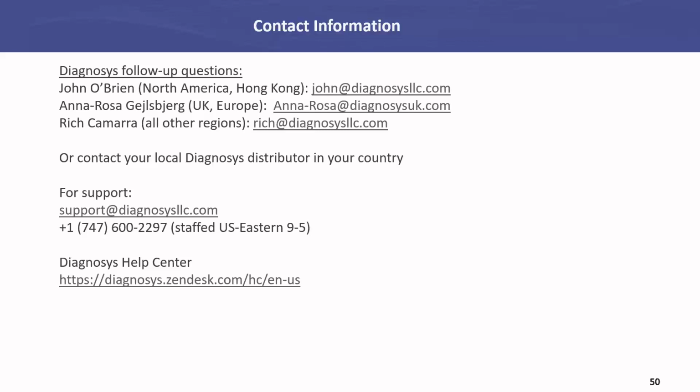I know you can get better responses if you use an alligator clip on a skull post, and that's fine. But that was taken at a customer site, and what they were looking for was a quick and dirty VEP to get a full picture of the visual pathway of those animals. So they were just using a needle electrode in the back of the head, and then a reference needle in the snout.